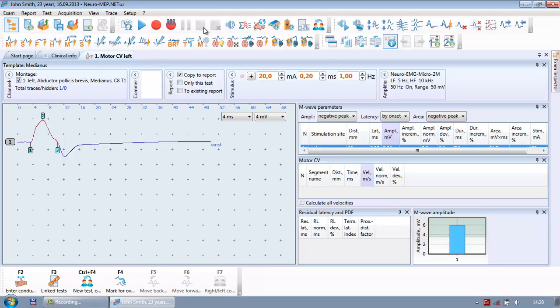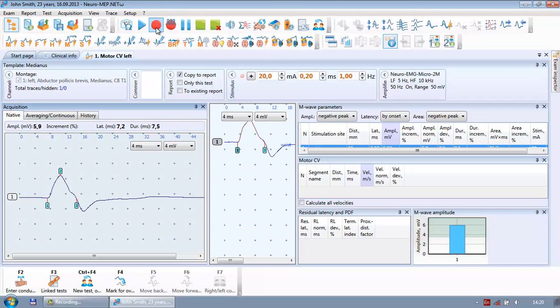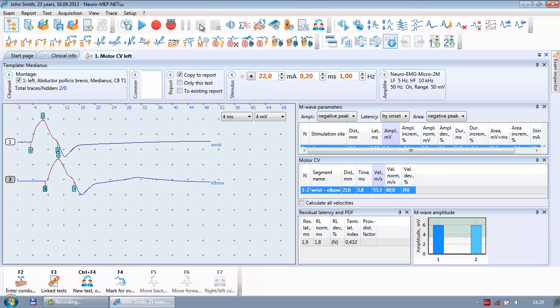Now I am ready to make the next stimulation point. I move the electrode to the next stimulation point, make a stimulus, increase the current, confirm it is no longer growing, and save. Now I have two curves.